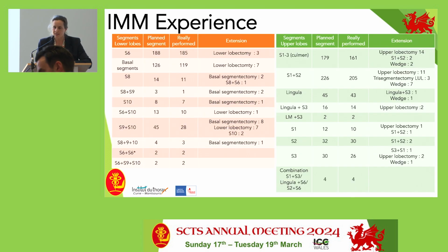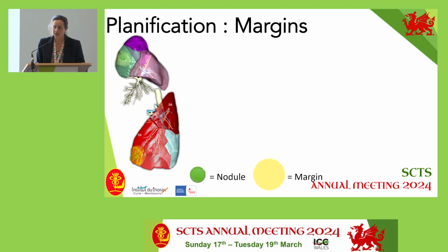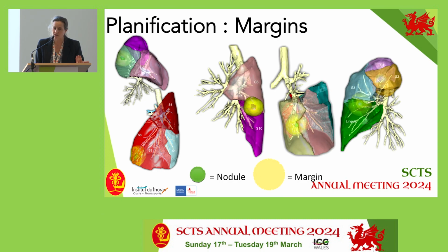doing before. So just a quick overview that we have tried all segmentectomies. And it's not only to see the vessels, it's also to have a better planification of the margins.